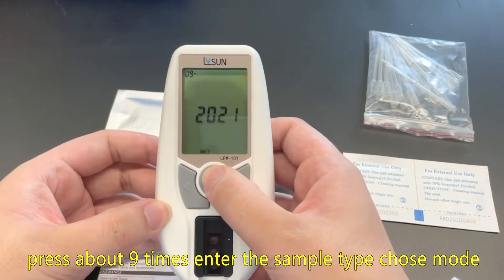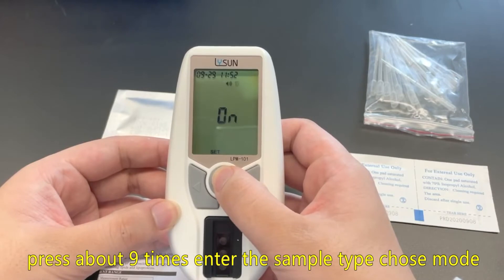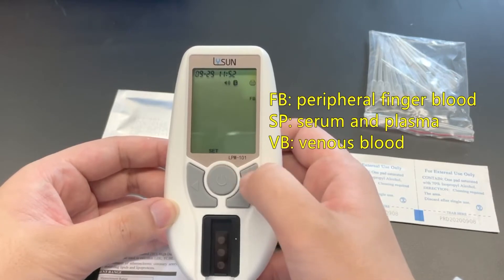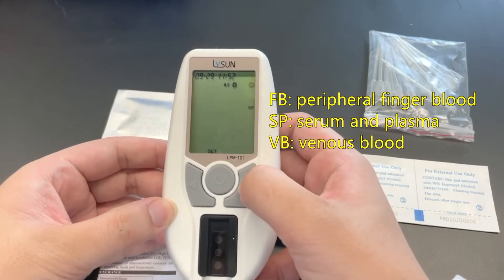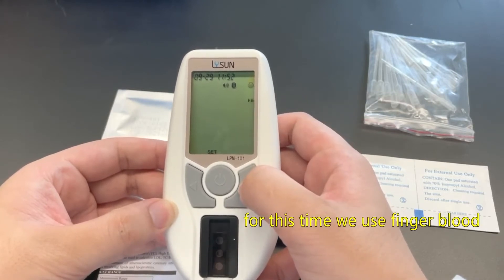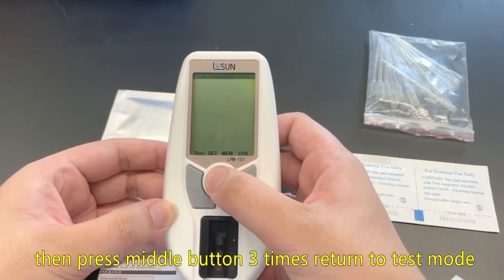Press about nine times to enter the sample type selection mode. FB: peripheral finger blood. SP: serum and plasma. VB: venous blood. For this time we use finger blood. Then press middle button three times to return to test mode.